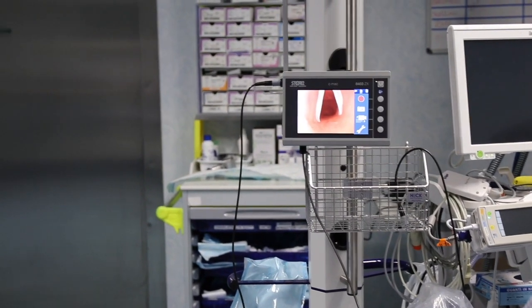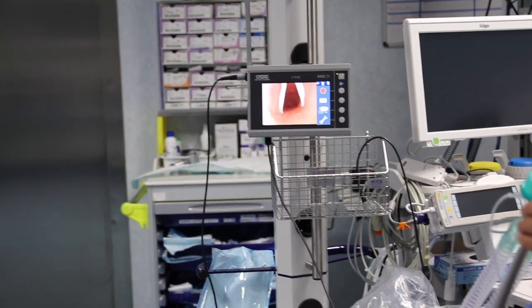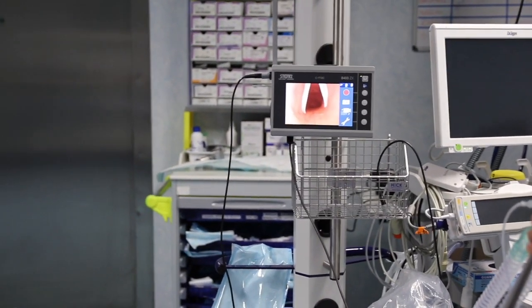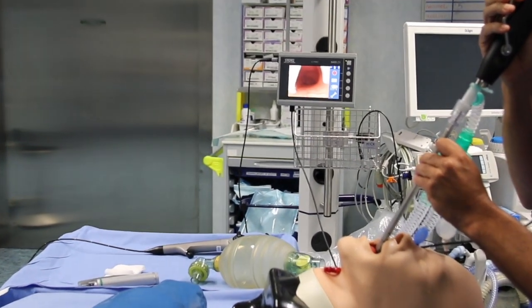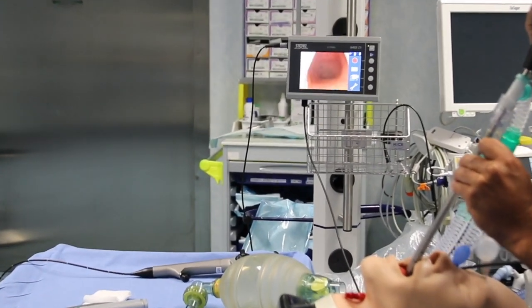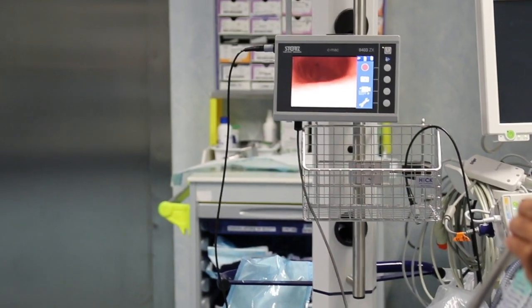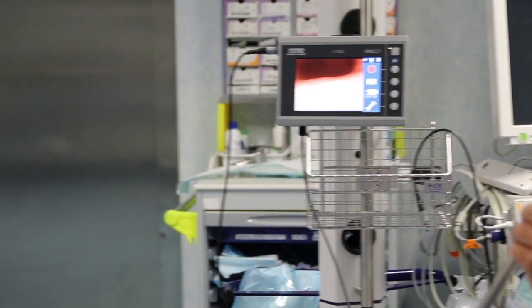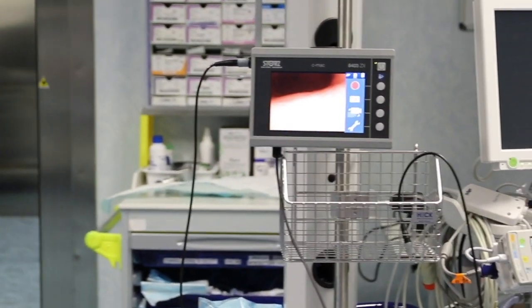Our patient is still being well ventilated. Approach the vocal cords with the video stylet and enter the trachea.